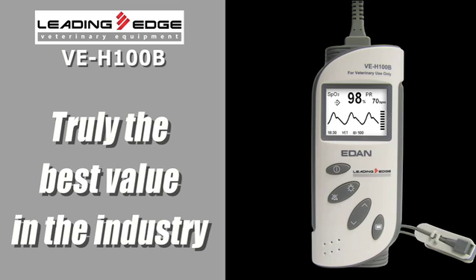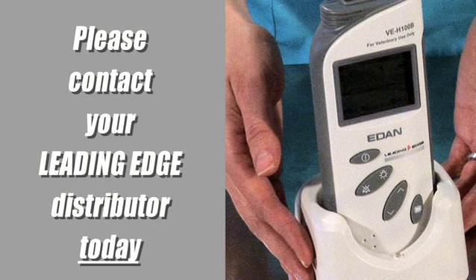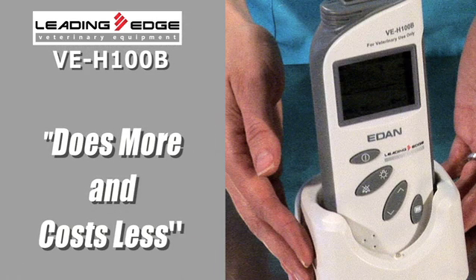Candidly, it's truly the best value in the industry, without question, for a price you'll have to look at twice to believe. Contact your Leading Edge distributor today to order the VEH-100B, and once you start using it, you'll wonder how you ever got by without it. The VEH-100B — it's simply a fantastic piece of equipment that does more and costs less.